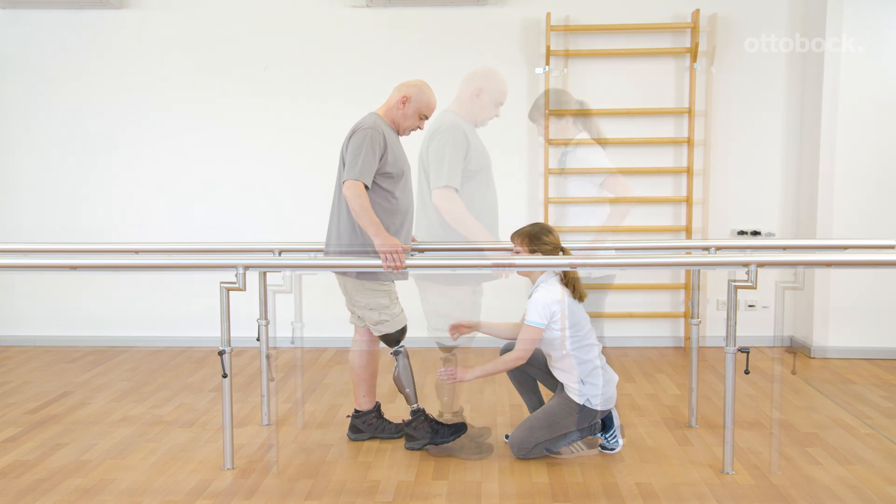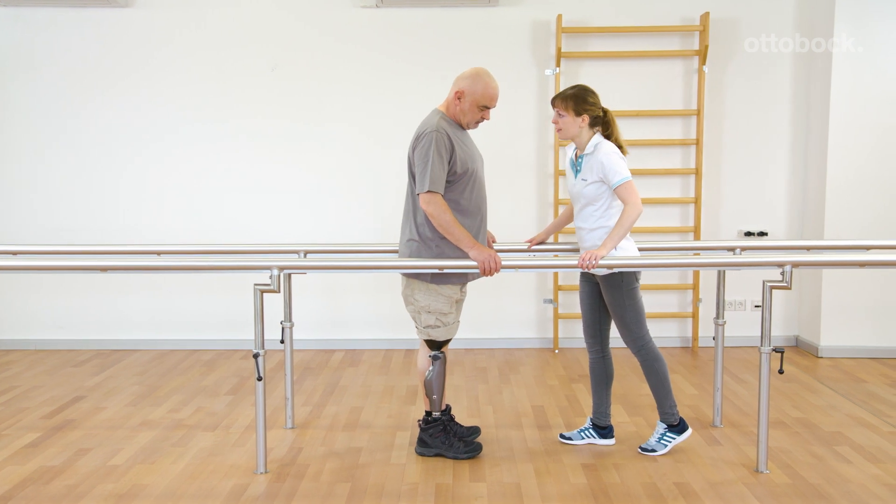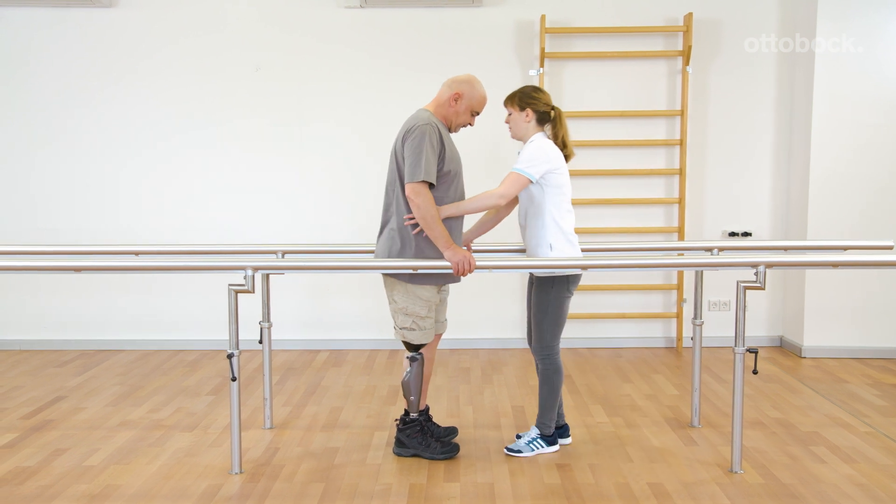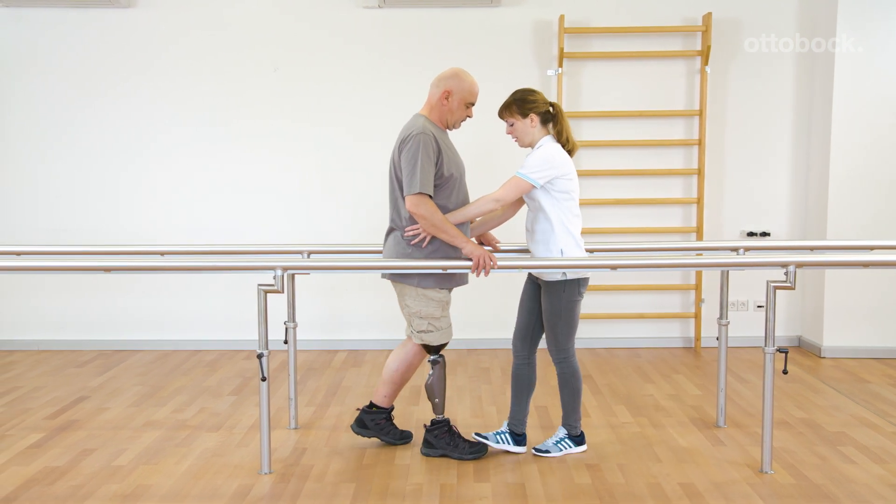Gerhard can also use the yielding for going backwards. In order to do this, he slightly pushes into the prosthetic knee joint while stepping back with the contralateral leg.